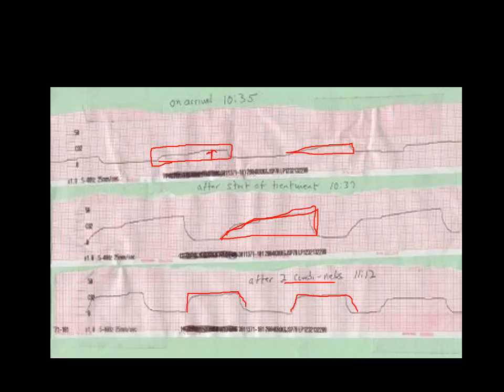In addition to this, I would also check breath sounds. I would expect to hear diminished here. I would expect to hear wheezing everywhere here, and then here at the bottom I would expect to hear clear. Maybe some residual here and there, but look, we've given 2 treatments. We show a progression from before, after the first treatment, after the second treatment, we show an improvement.